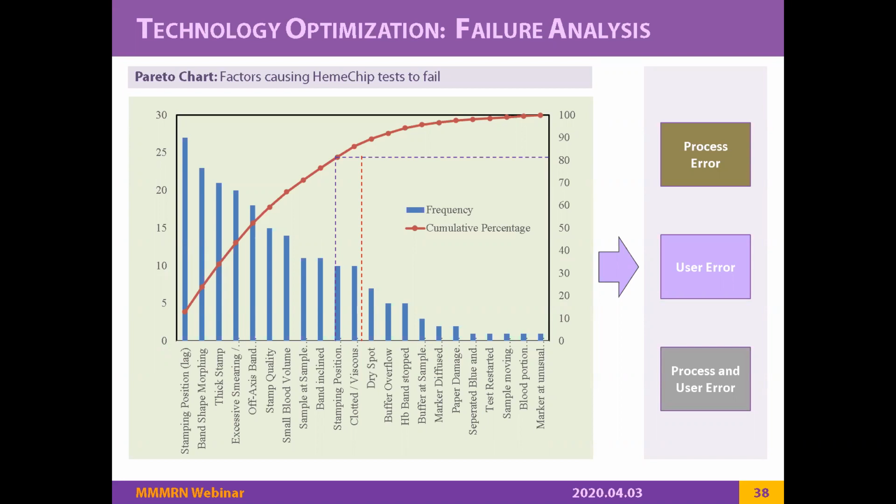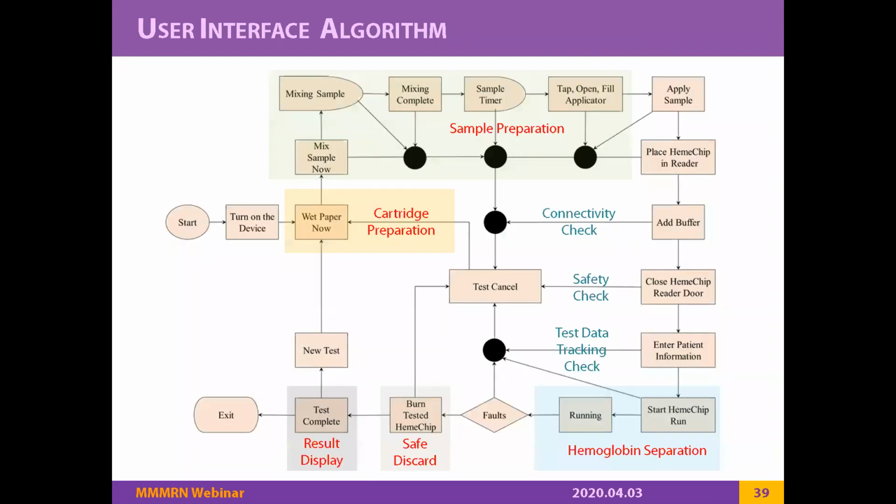And to build up that capability took us at least a year, because when you take a system from the lab and give it to people who don't have any expert skills, things can get messed up pretty easily. And you can see in this plot, it really got messed up. And then we had to come up with a foolproof algorithm strategy, how we can transfer this technology to anyone who doesn't have any science or technical background. Once we established that, then we started to get our data and those field tests.